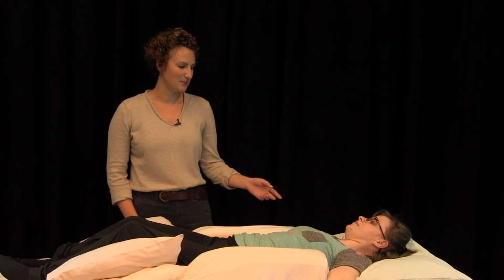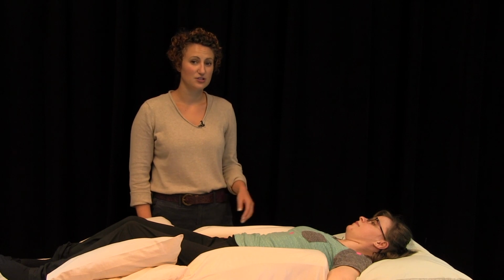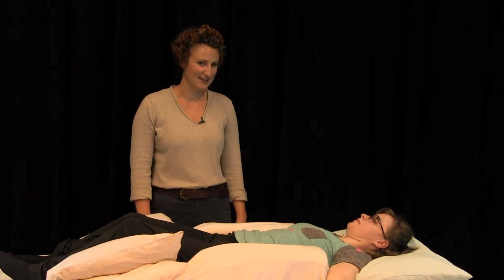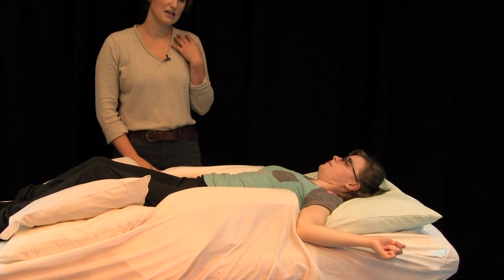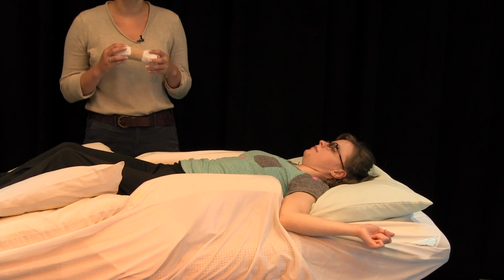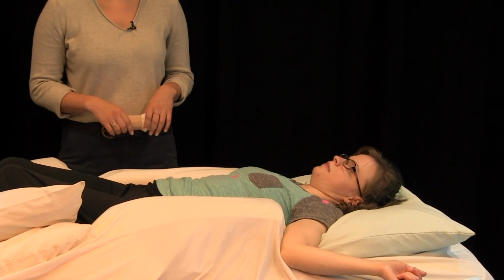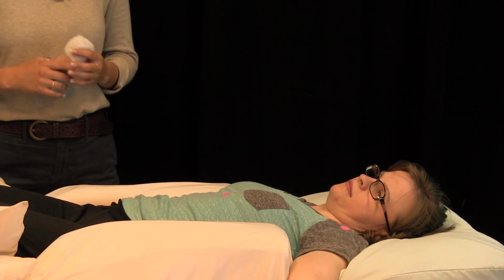Moving further up the spine, observe the position of the user's head and neck. If the user typically sleeps with a pillow, then use a pillow to fully support the head and neck. If the head is rotated or easily rolls to the side of the face, you can place one small support under the pillow to nudge it towards the center. You can also place two small supports under the pillow to act as a cradle for the head.